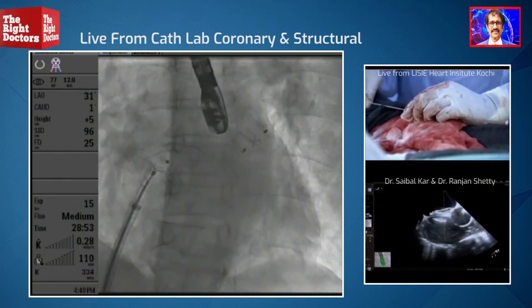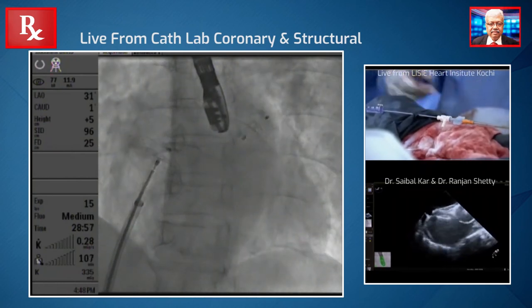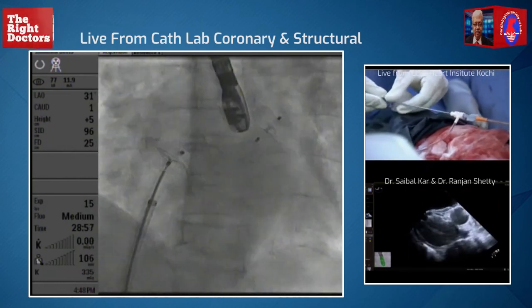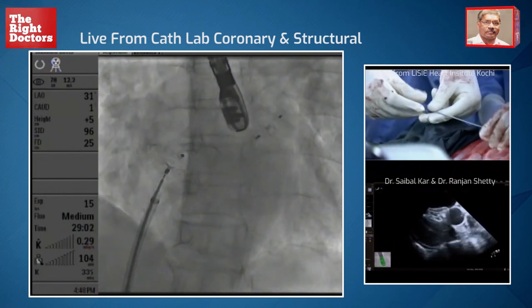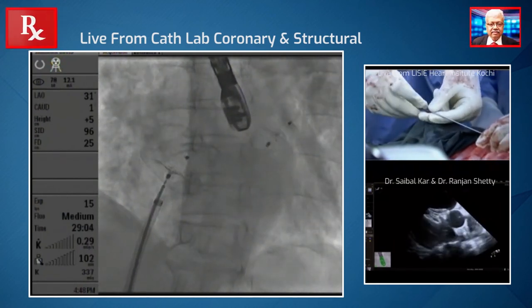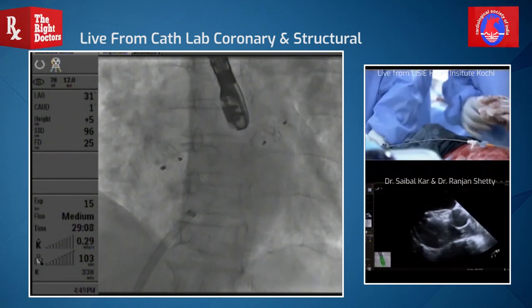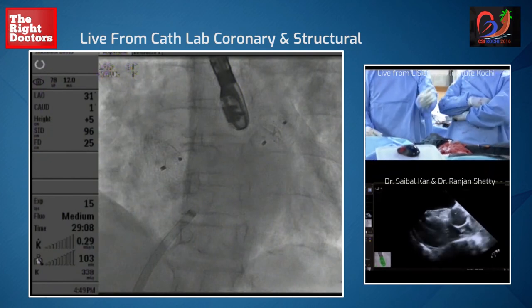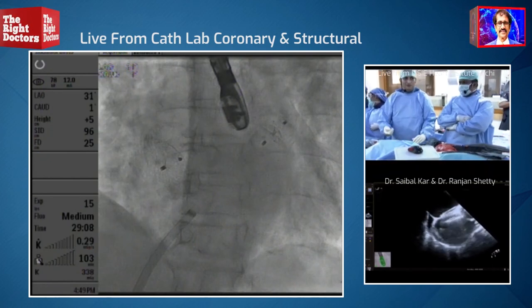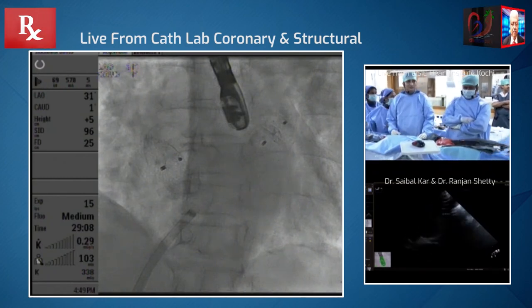And now we're going to just deploy the device and we're done here. Look at it — perfect! Can you show a layer also? This is very nice. Let's do color — both the one. One device here and one device there. Very nice.